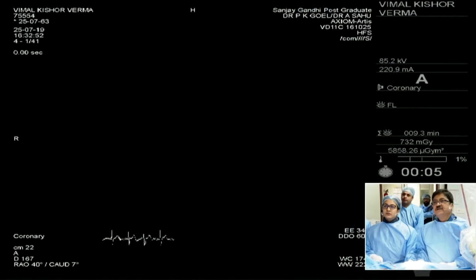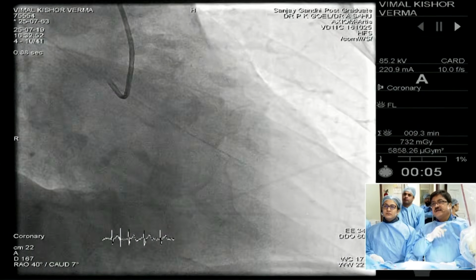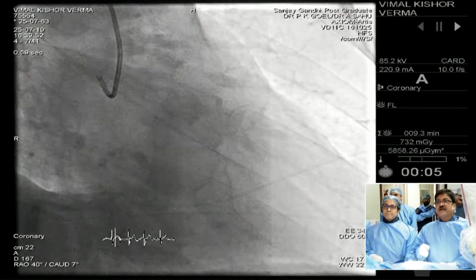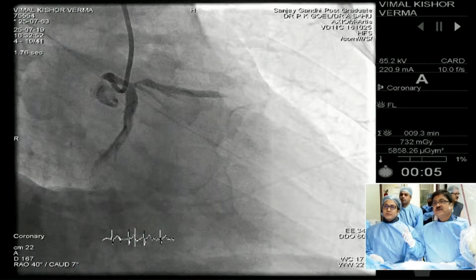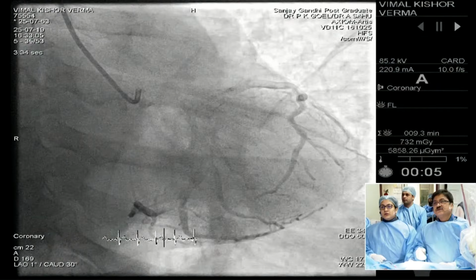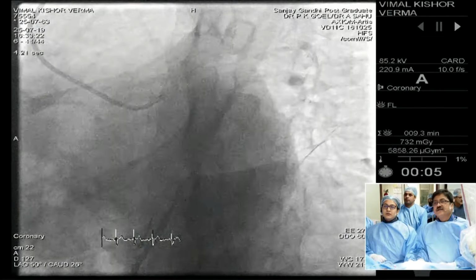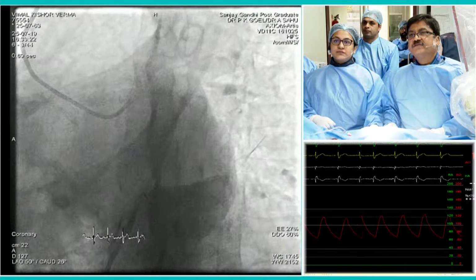That's the caudal view. Now you saw the left main in that one, and you see there is an ostial LAD very tight, and there is in fact a slow flow in the LAD, suggesting the critical nature of the stenosis. And then there are some more shots. So the LAD is filling slow. Again, move forward. So that's the critical disease on the LAD ostium, and there is left main disease at the bifurcation and at the ostium. Next. And LCX, well, looks okay.